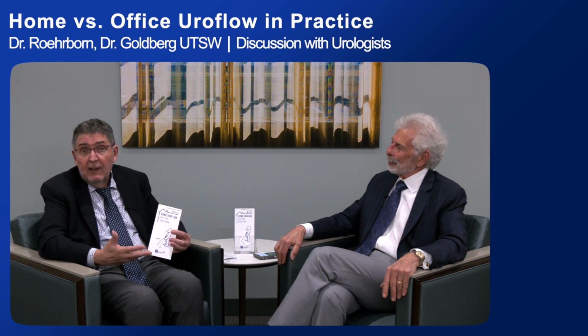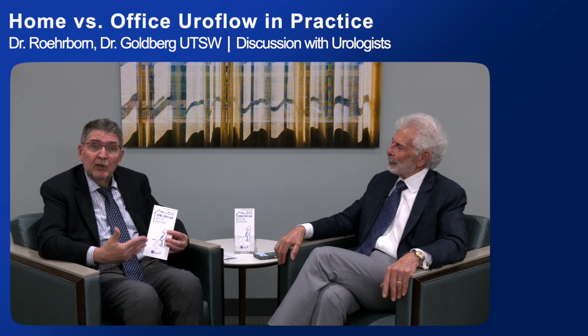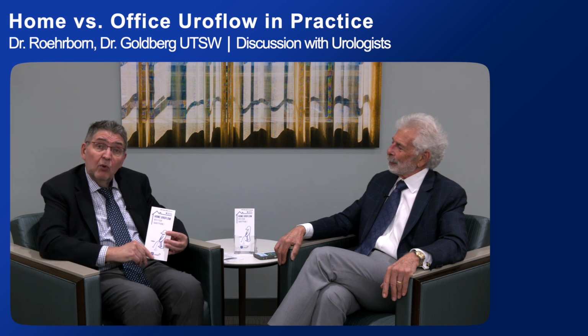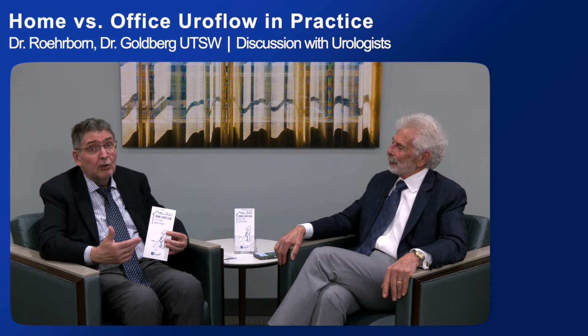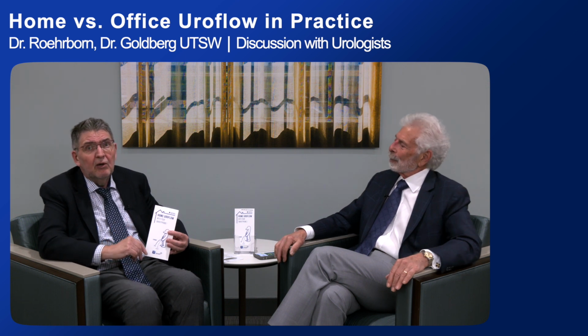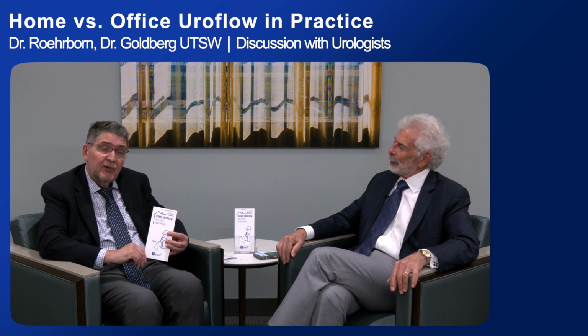And you could see how this tool might help us in the initial assessment, in the follow-up on conservative management, let's just say watchful waiting, or under medical therapy, or after surgical therapy, without the patient really having to set foot in the office, clogging up maybe your patient flow, not being well prepared, having to drink water and wait. And we all know how much of a drag that can be for our patient and for our staff. So it's an interesting new aspect and new way of thinking about medical management.